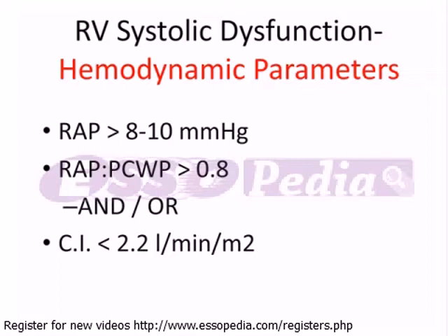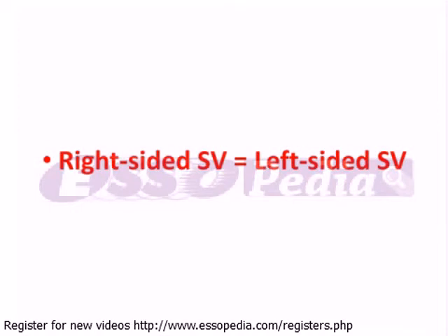We've touched on the concept of stroke volume before in the evaluation of fluid responsiveness. Of course, stroke volume is one of our classic measures of function as it relates to both cardiac index and cardiac output. Recall that due to the concept of ventricular coupling, left-sided cardiac output has to be the same as right-sided cardiac output in the absence of significant shunt. We'll therefore briefly review left-sided stroke volume measurements, as it's much simpler to measure on the left side.